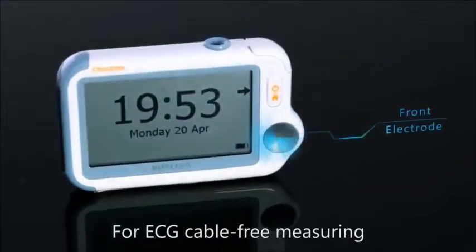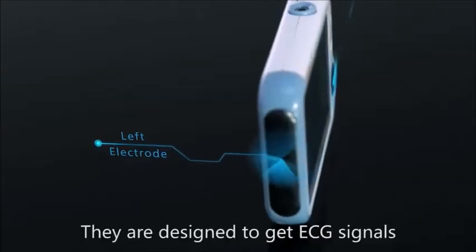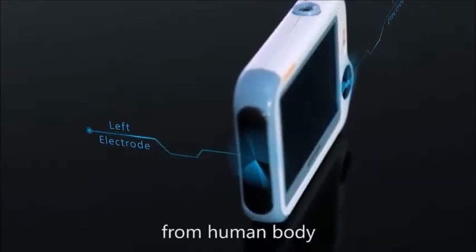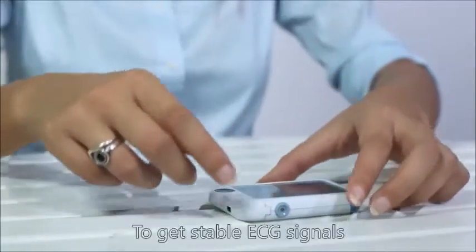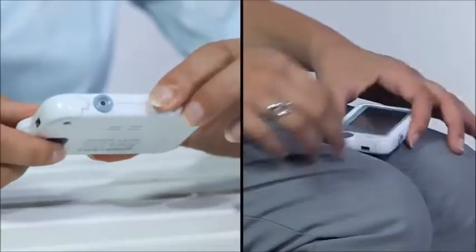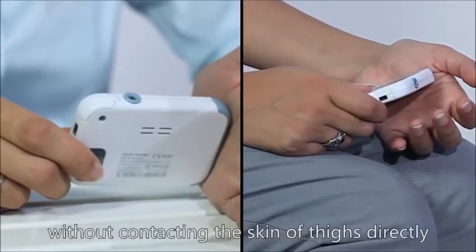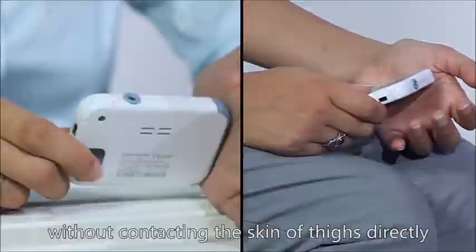ECG cable-free measuring, there are three electrodes, the front, the back, and the left. They are designed to get ECG signals from the human body. To get stable ECG signals, rest your hands on a table if possible. If a table is unavailable, rest your hands on your thighs without contacting the skin of the thighs directly.